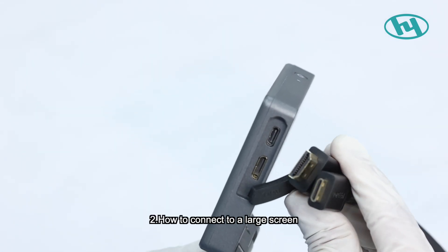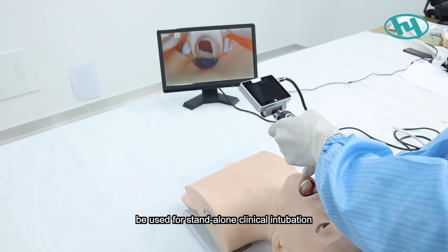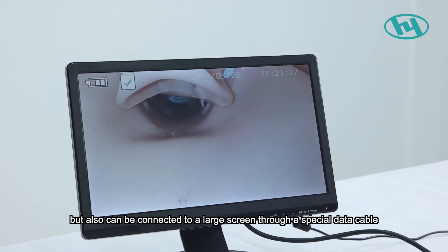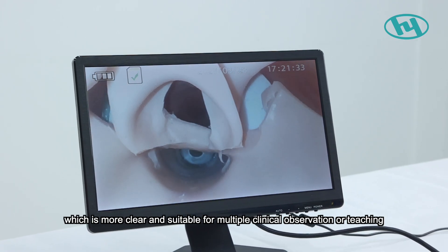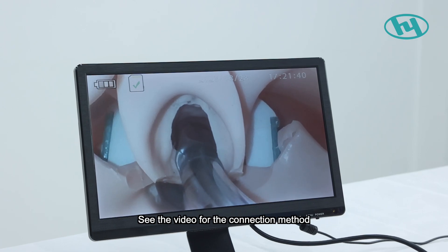How to connect to a large screen: The HYHJ-KM video laryngoscope can be used for standalone clinical intubation or connected to a large screen via a special data cable, so the intubation process can be displayed more clearly for multiple clinical observation or teaching. See the video for the connection method.